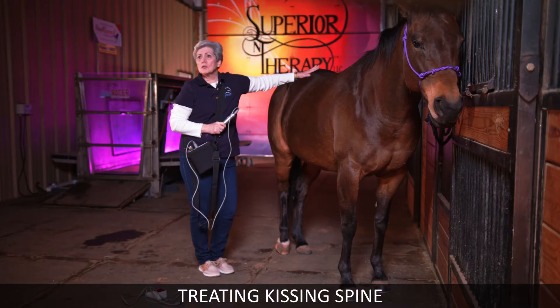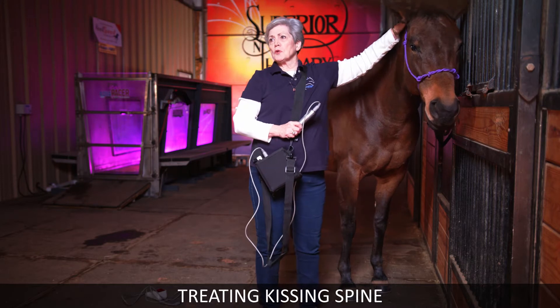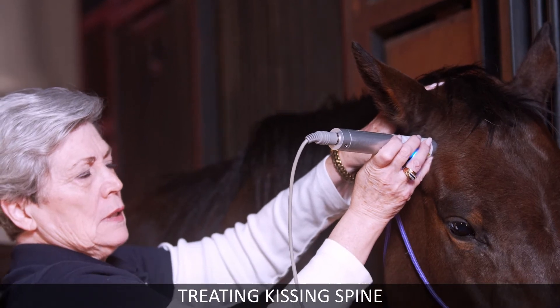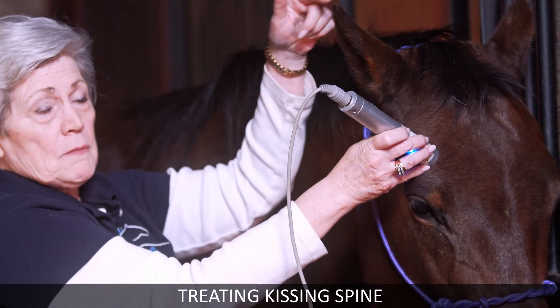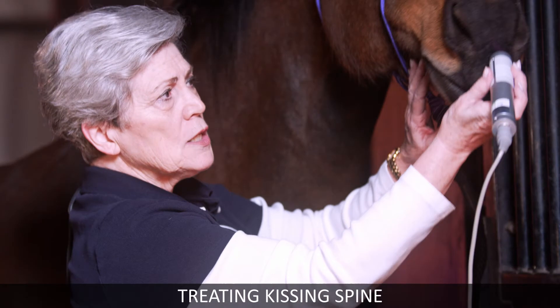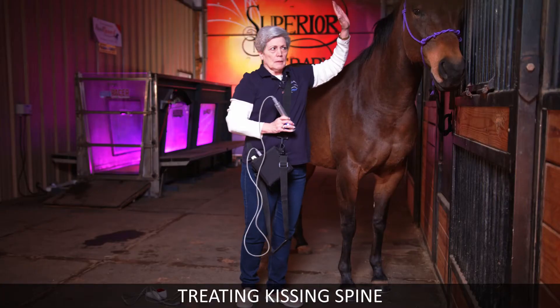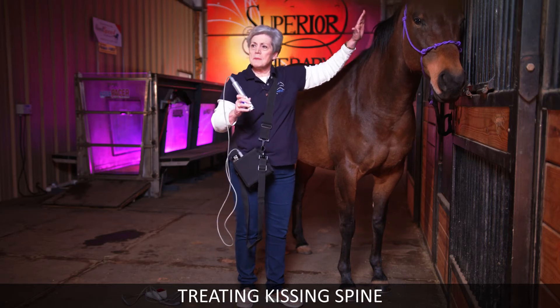I want to show you what to use to calm the horse. Be sure to do this a minimum of 20 minutes before you ride them. We're going to treat under the ear, then in the soft spot above the eye — doing both sides of course. Then treat the area on the lips, but save that for last. If they fight it too much, just leave that one alone. Do all of those places at least 20 minutes before you run them. It takes 20 minutes to get the full effect of a laser treatment.